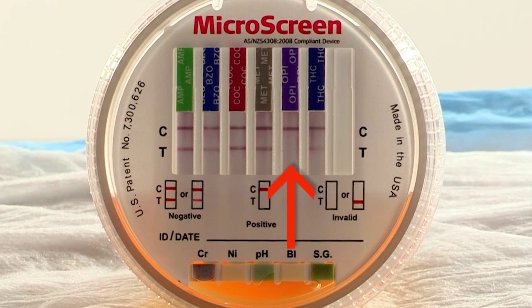That means that this test is not negative for opiates, and the consequence of that is that we are now required to process the rest of this urine specimen and send it off to the laboratory for confirmatory testing, which takes approximately 3 days to get the results back.